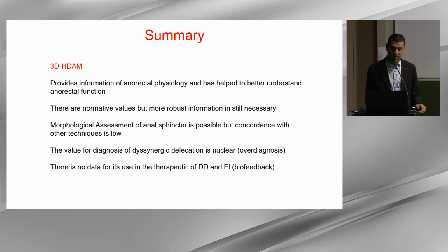Morphological assessment of the anal sphincter is possible, but the concordance with other techniques is low. And the value for diagnosis of dyssynergic defecation is unclear with this technology, so we have to use it with caution. There is no data to support its use as a therapeutic tool for biofeedback in dyssynergic defecation and fecal incontinence. That's the reason I didn't show anything about it.